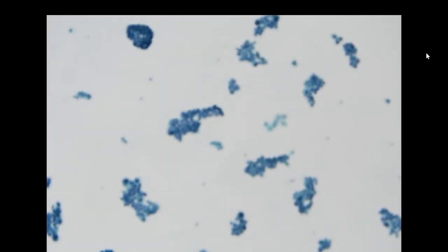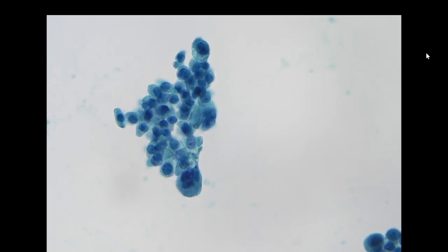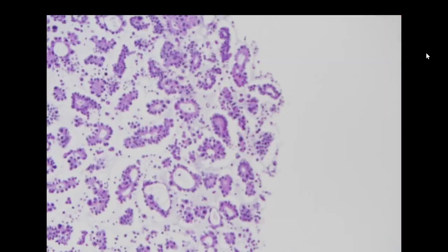So we move to pleural effusion. We have a lot of lung cancer today as well. And this is coming from a new patient, a 46-year-old female, so very young. And here we have a classic cluster of cells arranged in a glandular pattern. And the cells have prominent nuclear atypia, so this is consistent with primary lung cancer with pleural effusion involvement. So we will do TTF1 on this cell block, and this cell block is also good for molecular testing as well.